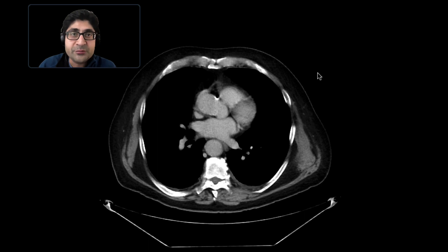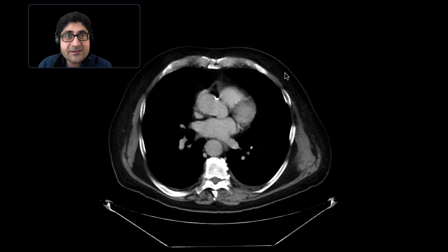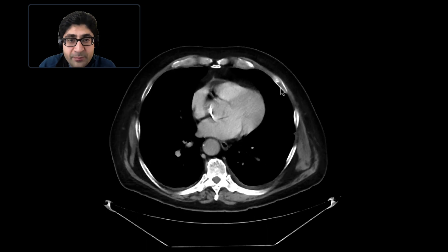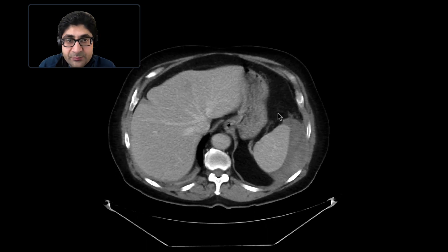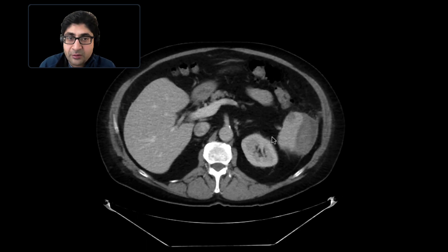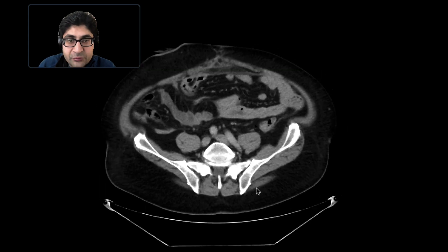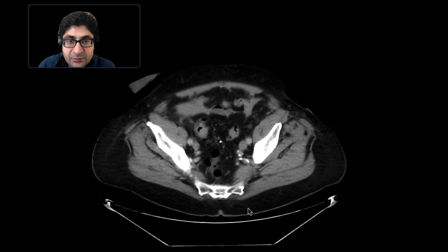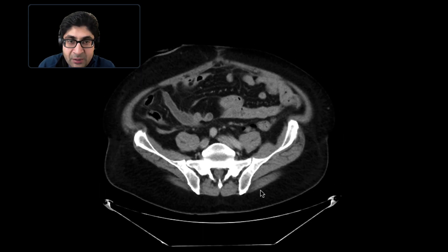This is a patient who presents with abdominal pain status post-colonoscopy. We've got a CAT scan to evaluate this. The one thing you worry about as we scroll through these images is the presence of pneumoperitoneum — you're looking for colonic perforation. Fortunately, in these instances, we don't see any pneumoperitoneum.